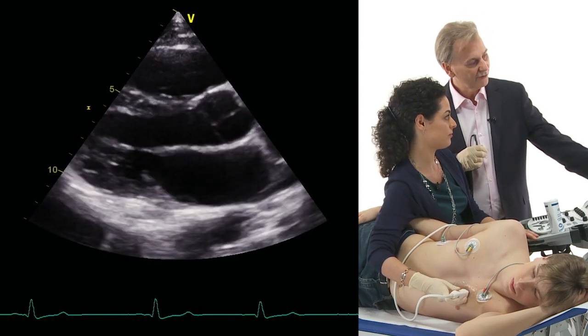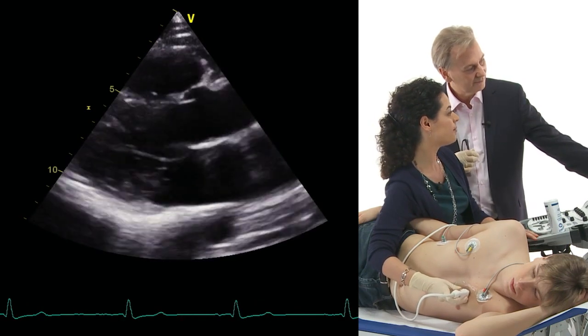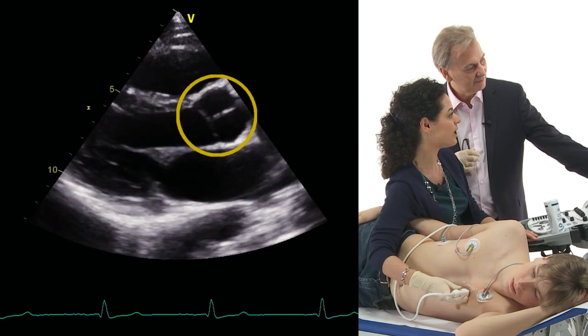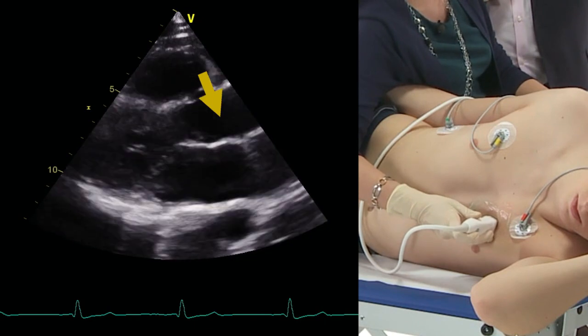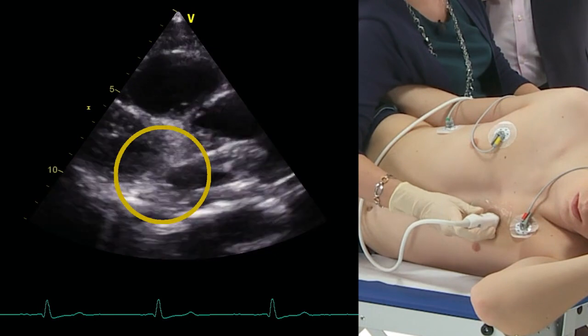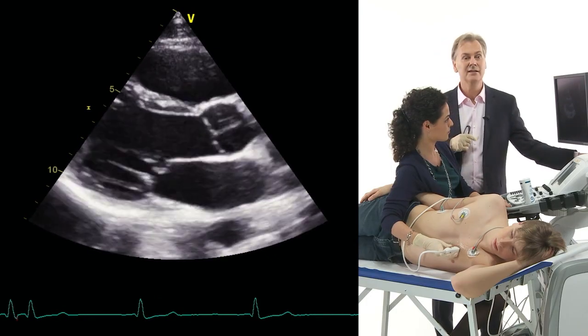So what are some of the structures we're seeing here? Or where is the aortic valve actually? The aortic valve we can really appreciate on top. We see two cusps and a line of coaptation, and the valve we see right below is the mitral valve. Okay, and there's another important structure that we can see here that we want to discuss in this chapter?